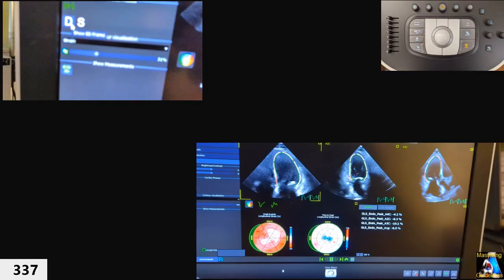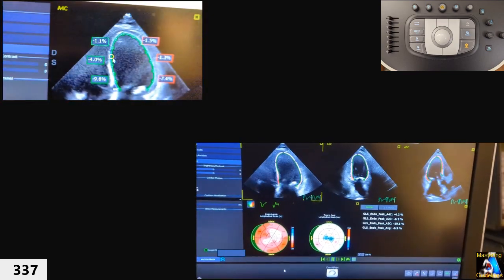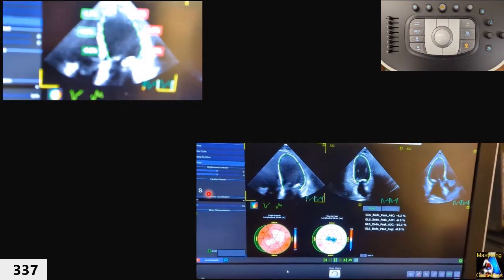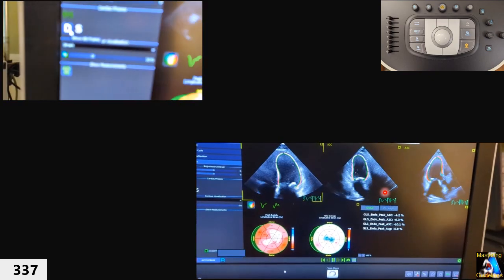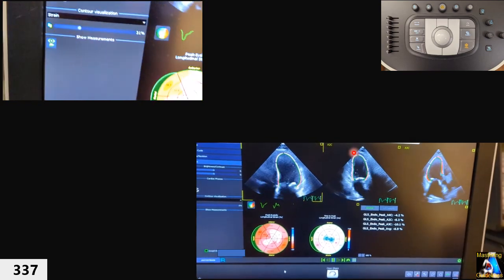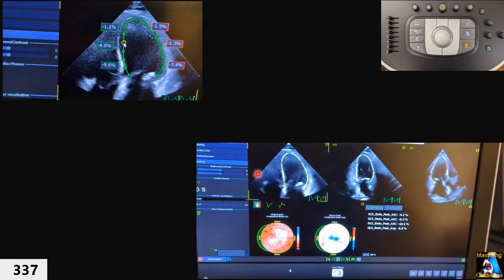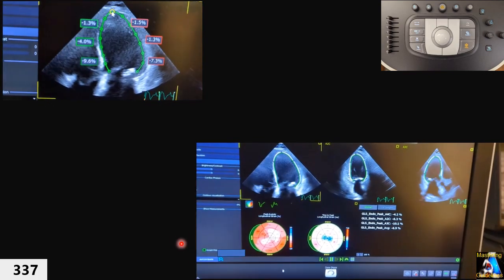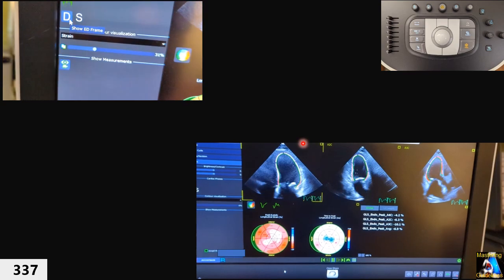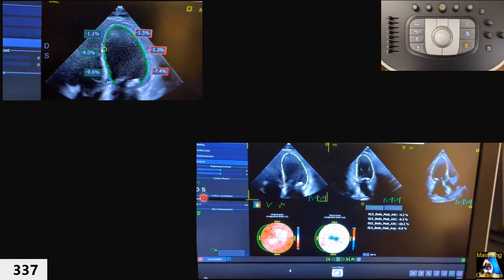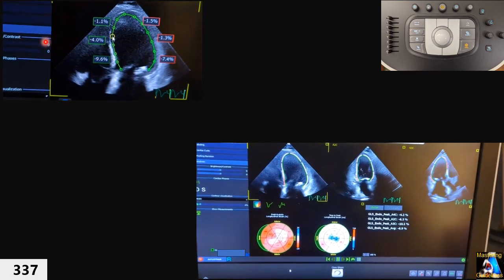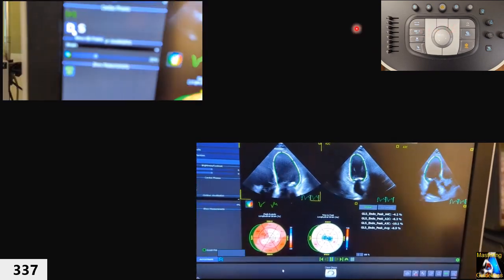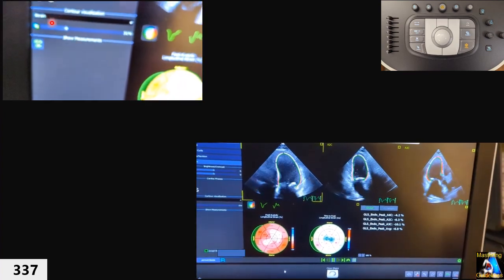Another method for adjusting segments is using the S and D markers on the cardiac phase display. This cardiac phase view is on the home page of Auto Strain. If you have navigated away, press the bottom-left double-arrow button to return to the home page. There you will see 'S' for systole and 'D' for diastole. Move the trackball to 'D' for diastole and press Select.